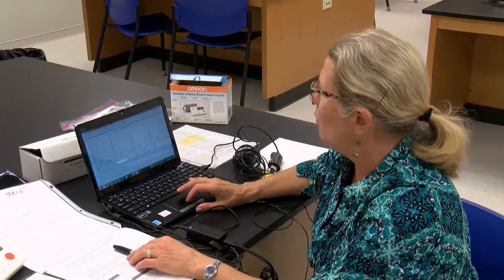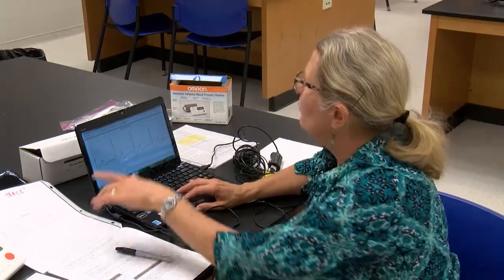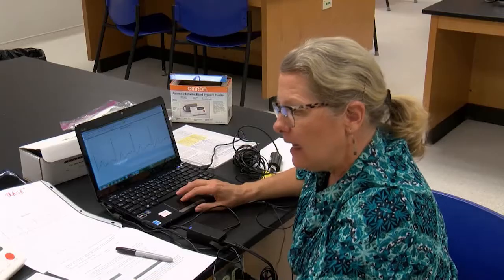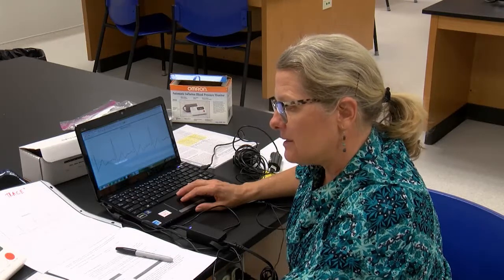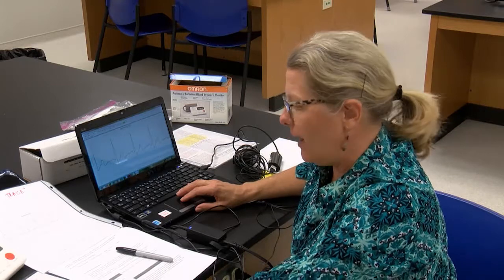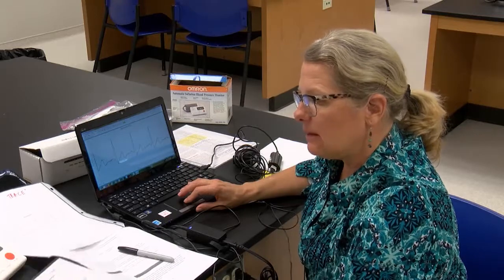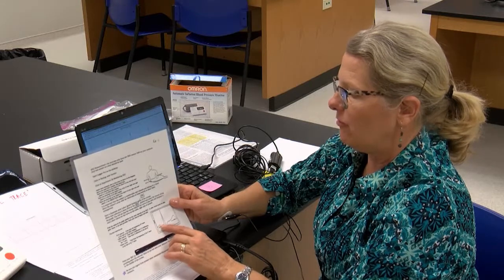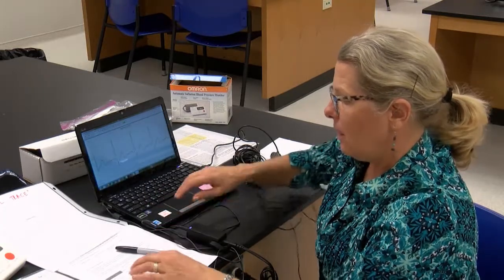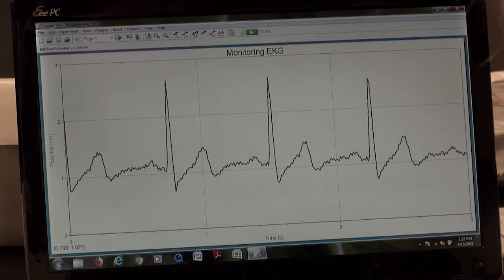All right, so what we need to do is use the x equals here, okay? And it says, when data collection is done, click on the x equals and move the mouse along the graph. We are going to do first the P wave. As this particular diagram says, the P wave is actually that first bump, okay? See how there's a bump here and here? We're going to call this our P.